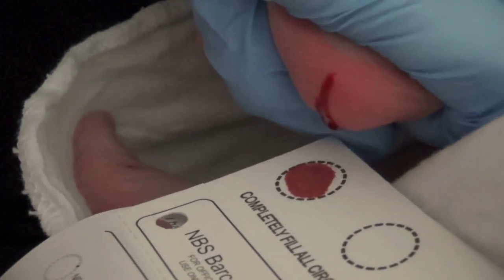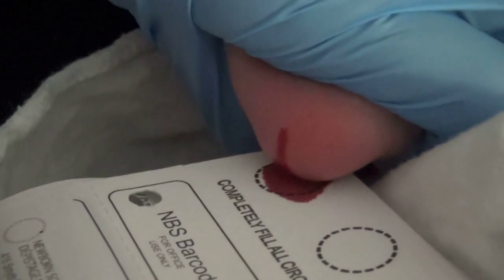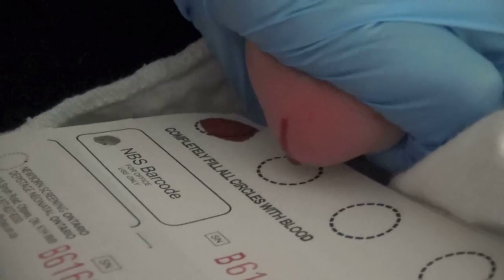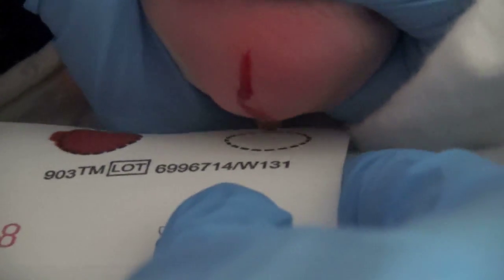If possible, completely fill each circle with a single drop of blood. Applying more than one drop to a circle is acceptable; however, avoid overlapping the applications. Avoid touching the collection card with the infant's heel — only the drop of blood should touch the paper.